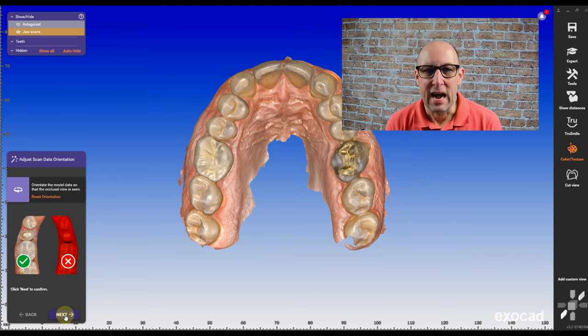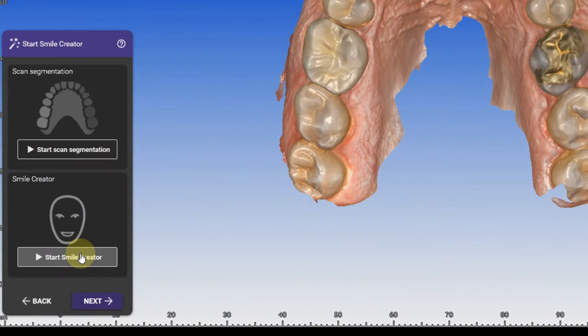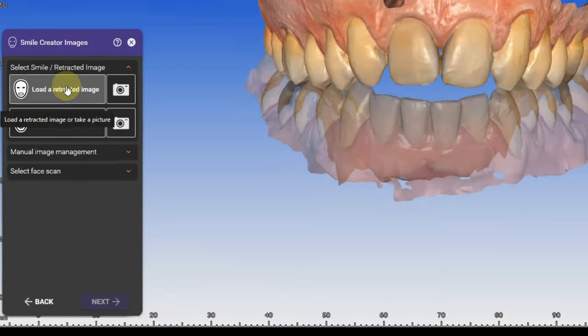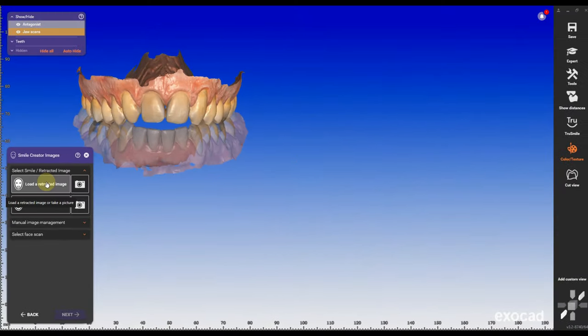After I orientated the arch up, I'm gonna go into the smile creator and I'm gonna load the retracted photo first.